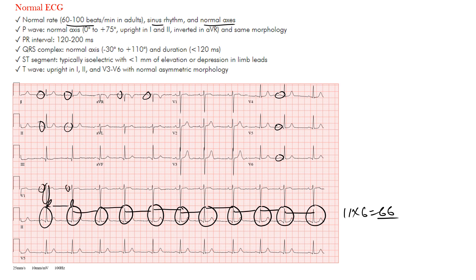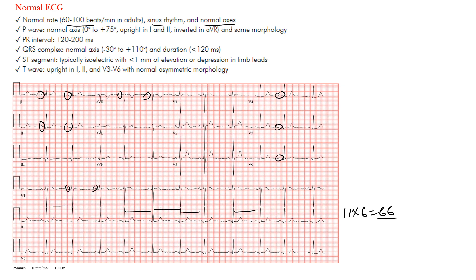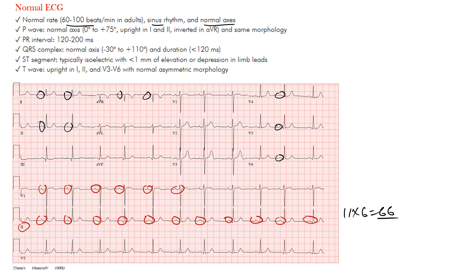If you look here, there is one P wave for every QRS complex — no dropped beats. Notice that in lead V1 all those P waves look the same; you want to have similar morphology of the P waves throughout. Same thing here in lead two in the rhythm strip — generally the same P wave morphology, no dropped beats, and every P wave has a QRS complex.